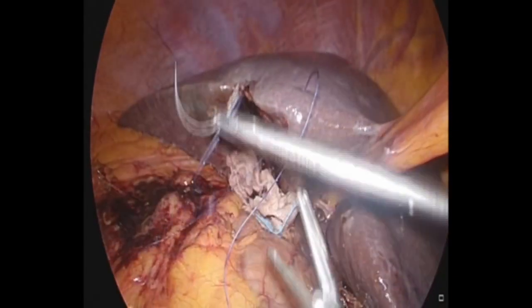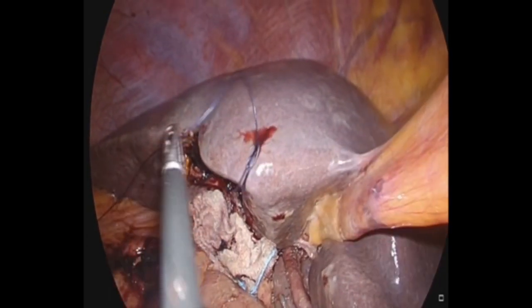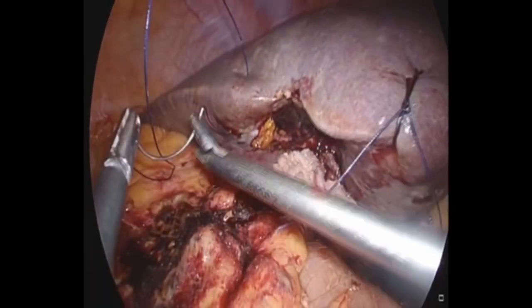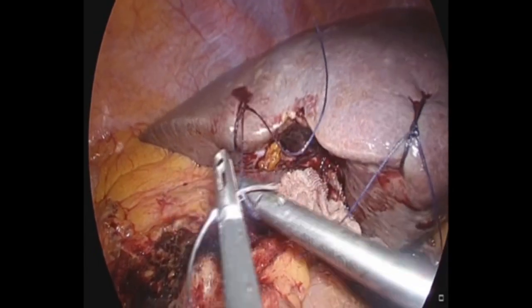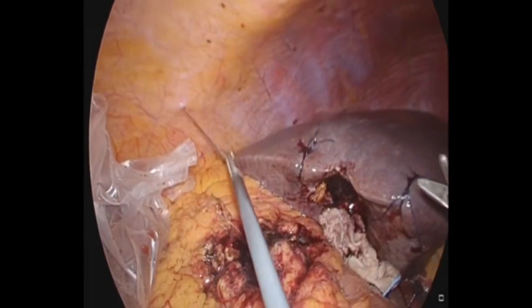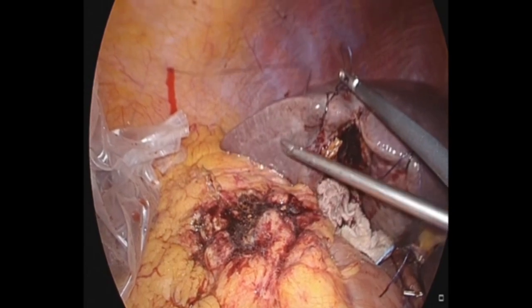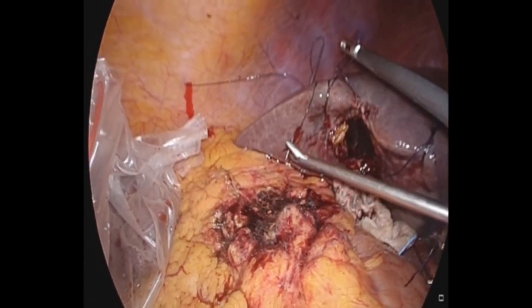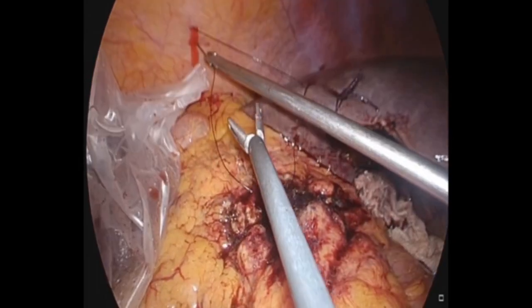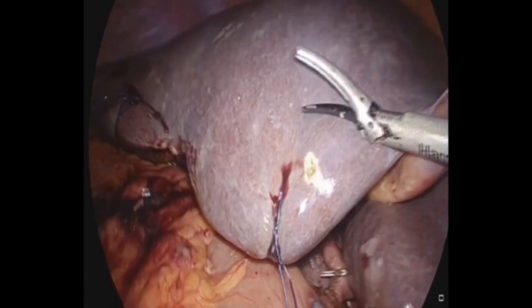In order to perform step two — the non-anatomic wedge resection of the liver — we place Vicryl sutures as retracting sutures in a U-type fashion: one on the left side of the gallbladder fossa and another on the right side, in order to retract the margin of the liver. Monofilament nylon sutures are placed literally onto the margin of the liver and taken out through the subcostal region, allowing retraction of the liver margin on both sides — medially as well as laterally.